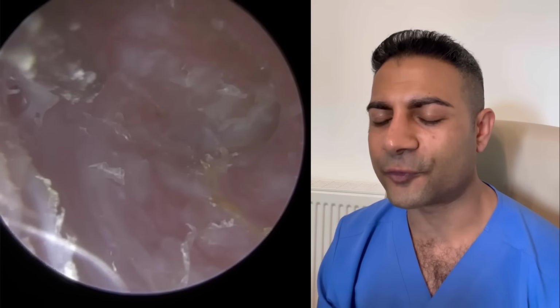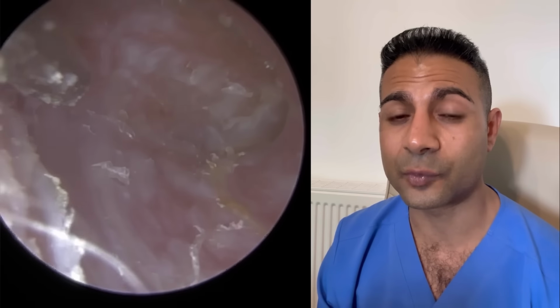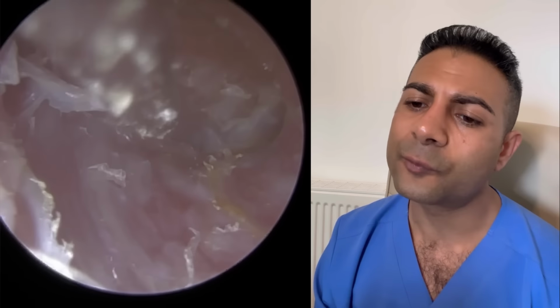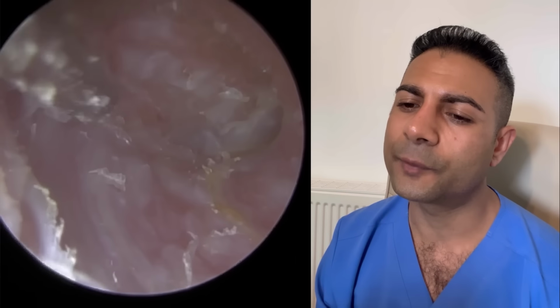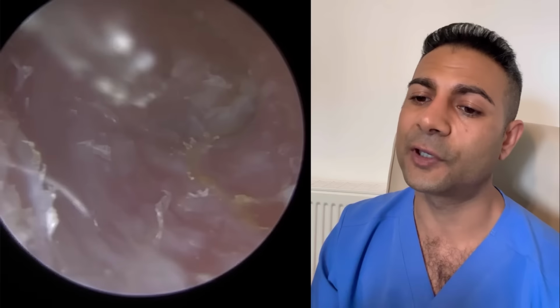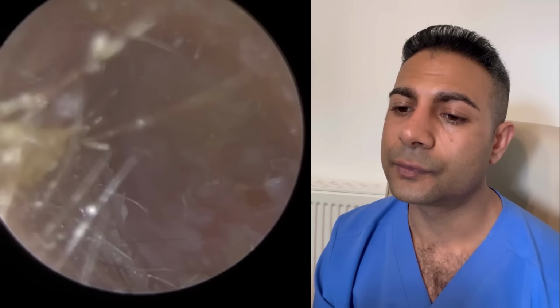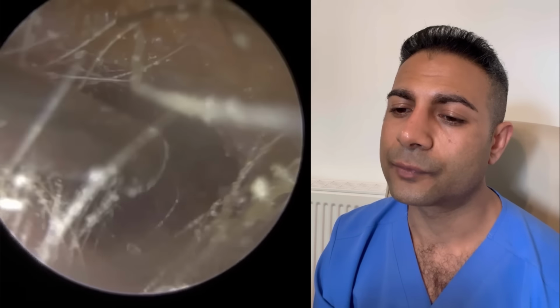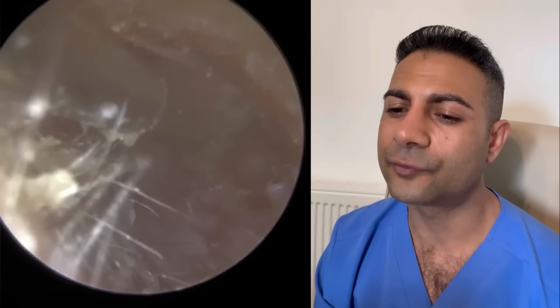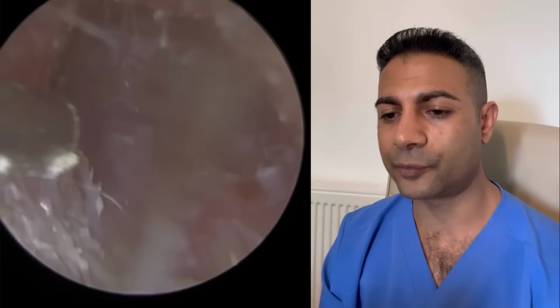And again, with stress, don't poke in the ear, don't get water in the ear, because it will just make their symptoms worse. So probably halfway in the ear canal, near the top, although it looks like the back part of the ear canal because of the way I've angled the endoscope, it's actually more at the roof of the ear canal there. So again, I'm just mopping up here. This is right near the entrance. This is on the cartilage portion. You can see it's got a bit of spring.